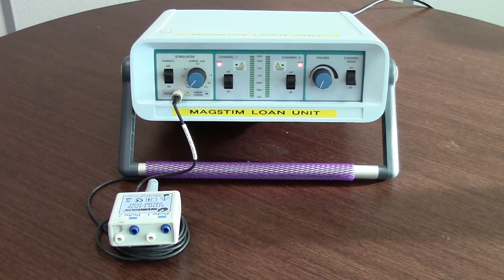To check that the stimulating pod is functioning correctly, switch your nerve monitor on. Followed by this, connect your stimulating pod to the front panel of the nerve monitor.